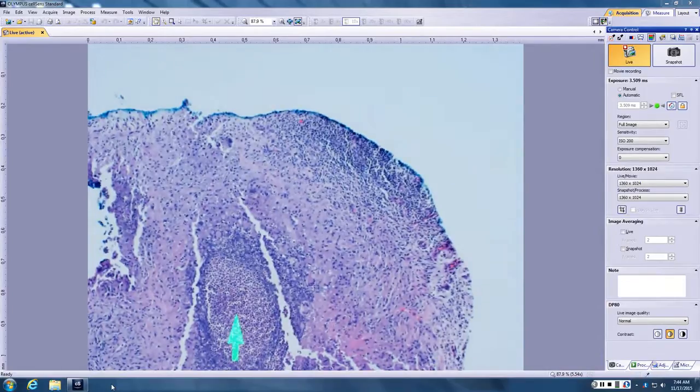So palisading granuloma with neutrophilic abscess in the center, what's your differential? Well, I think this is incorrect, but a deep granulomatous process like that makes you think of a rheumatoid nodule, but those should not have neutrophils in the middle. You are absolutely correct. Actually, you usually have just a little smattering of neutrophilic dust on the fibrin, which is in the middle. But here, what you have is just pus in the middle of a palisaded granuloma.